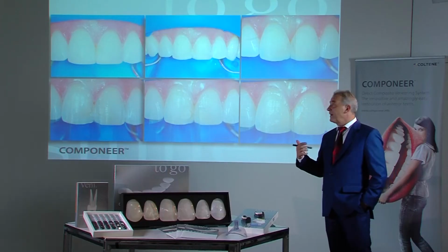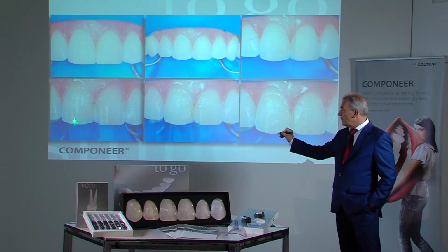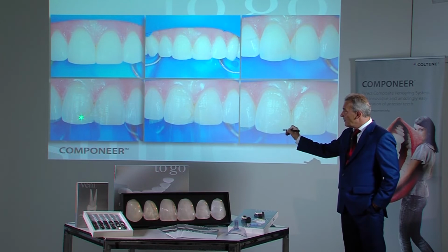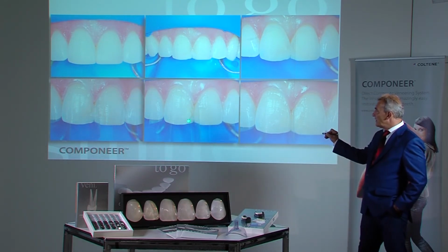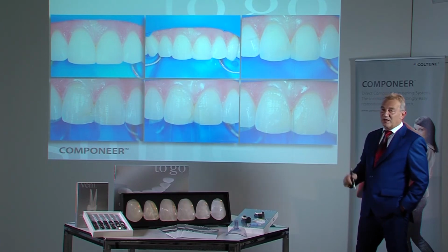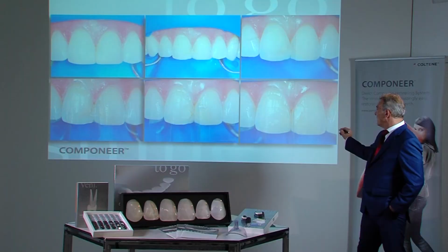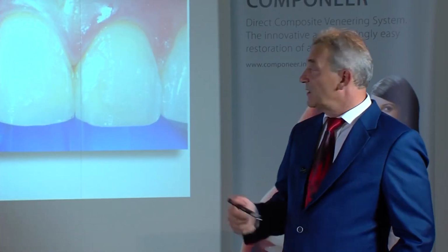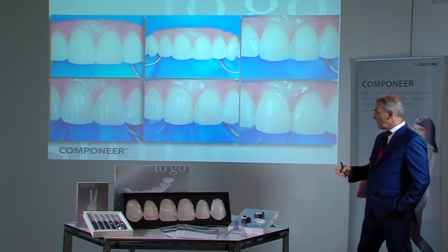To ensure that the outcome does not interfere optically, this region was covered with some dentine. After bonding, this discoloration or dark area would not be even more visible. And then to really see, does this have an effect or not? Here we are talking about approximately 0.1 to a maximum of 0.2 of a millimeter applied down here. As a rule, this is adequate to cover such areas.